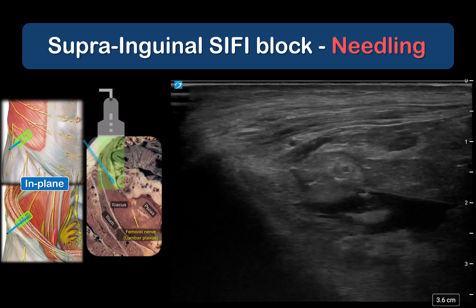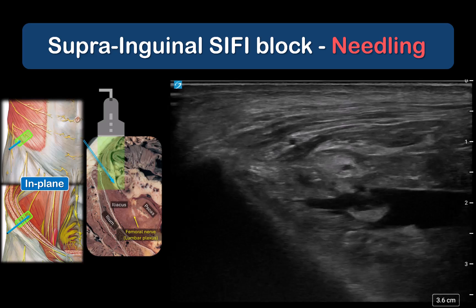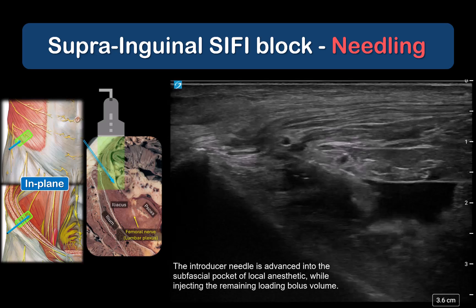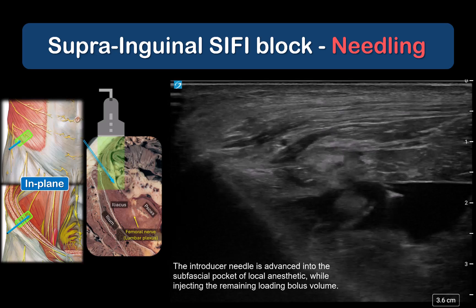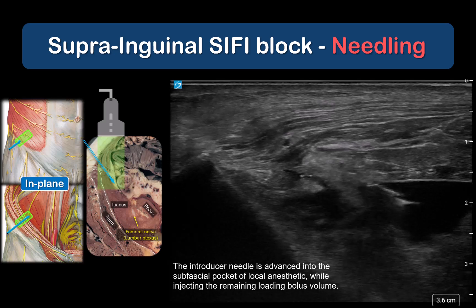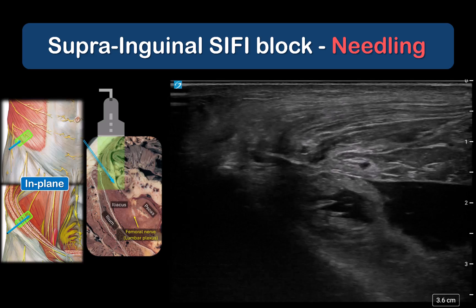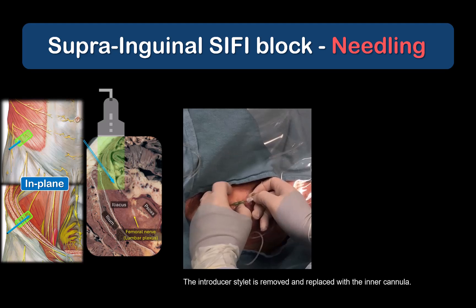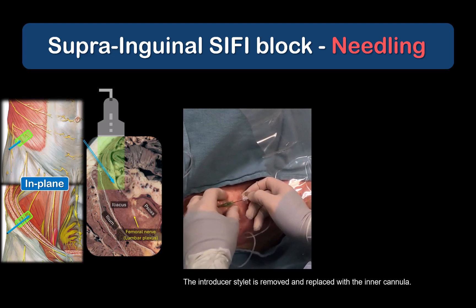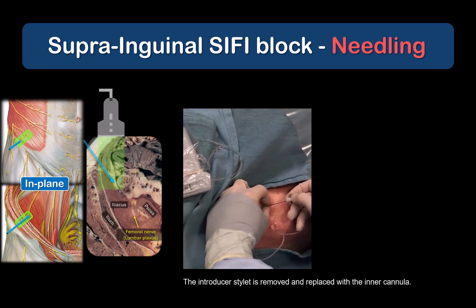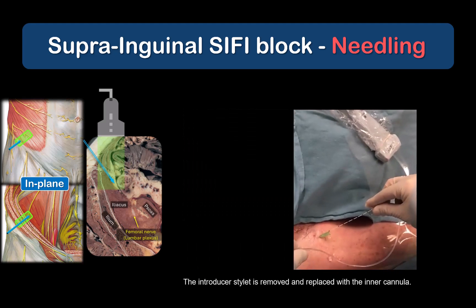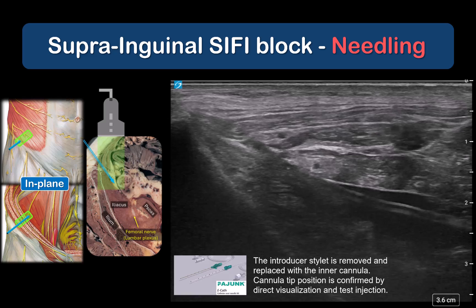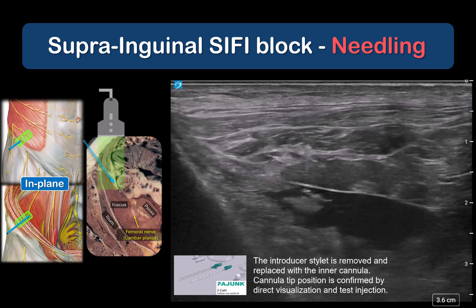The in-plane view allows more precise placement of the needle tip in the subfascial plane, and more importantly, facilitates accurate advancement of the introducer needle into the subfascial compartment under fascia iliaca as the loading bolus injection is completed. The introducer stylet is withdrawn and replaced with the inner cannula of the ECATH. Scanning confirms placement of the cannula under fascia iliaca and spread of local anesthetic injected through the cannula.